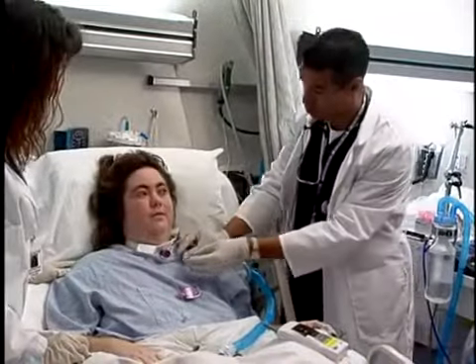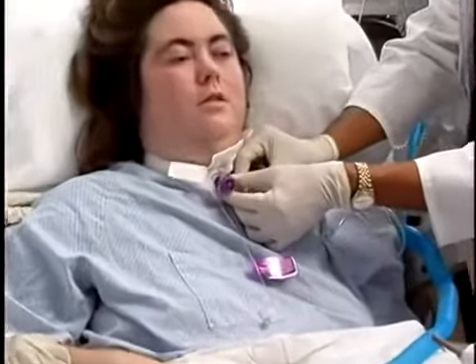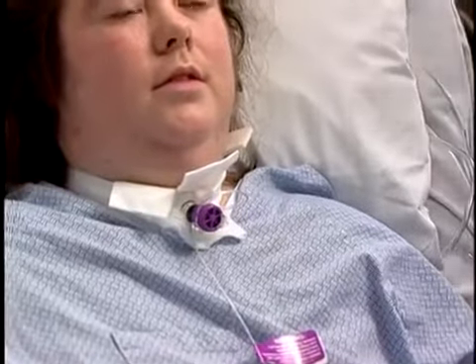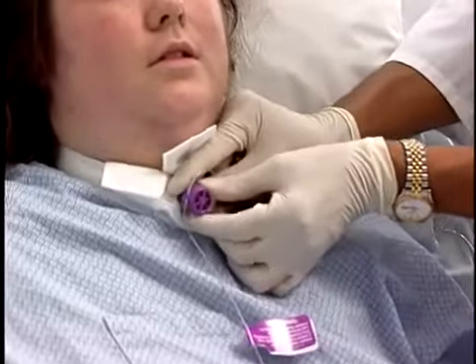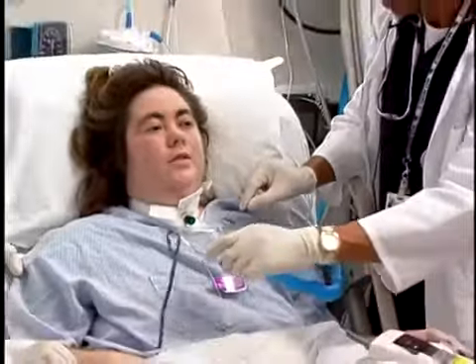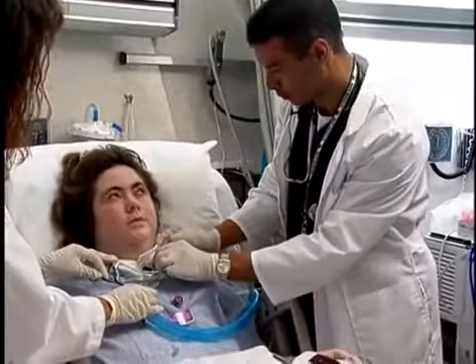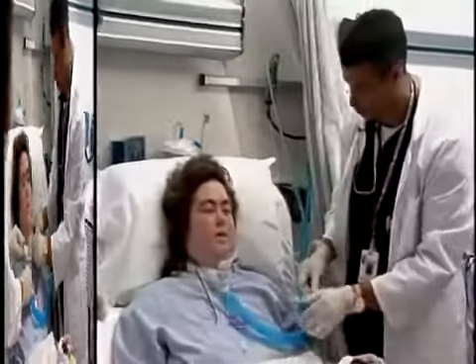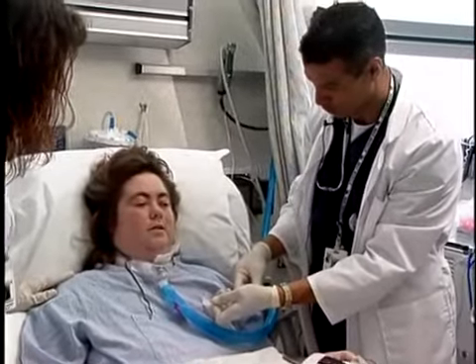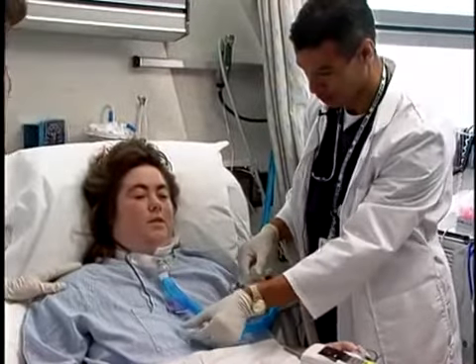At the end of the initial therapy session, remove the valve and monitor the patient. When removing the valve from the tracheostomy tube, place one hand gently on the neck plate to keep the tracheostomy tube from moving, and with the other hand, gently twist the valve off the hub of the tube. If using a tracheostomy tube that has a hub that rotates, it may be necessary to use a rocking rather than a twisting motion to remove the valve. Reinflate the cuff if present. Continue to monitor your patient after the valve has been removed to ensure stability.